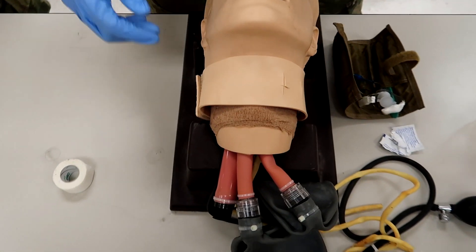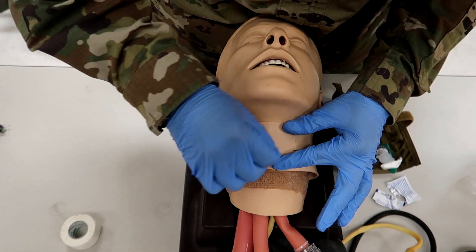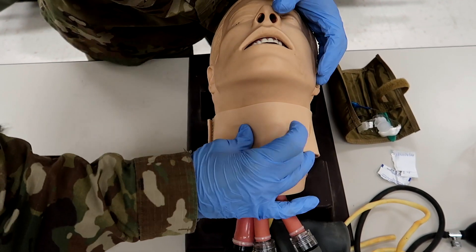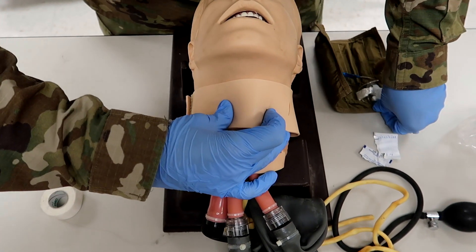Now that we've done that, he's going to clean the site with an alcohol wipe. And now he's going to stabilize the larynx with a non-dominant hand, confirm landmarks with dominant index finger. So you're going to reconfirm a lot, guys.